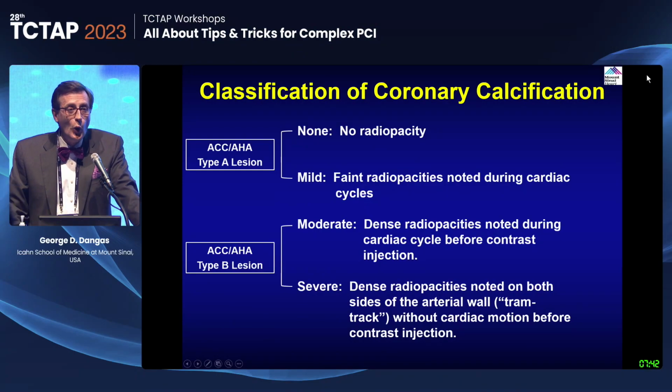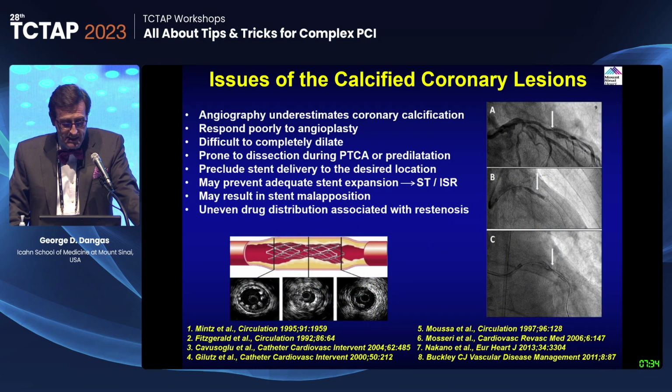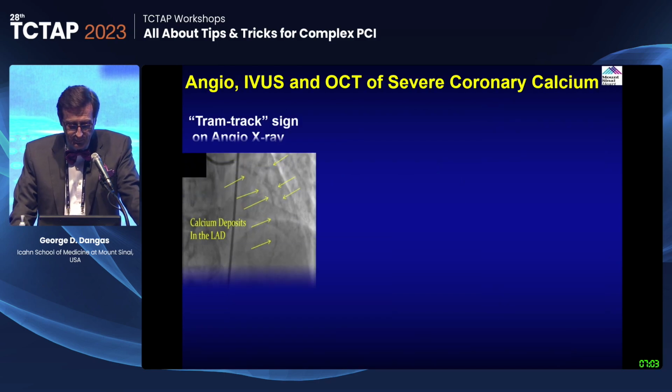And indeed, there are very old classifications of the calcifications of the vessels. You can see the original classification, as well as why we're dealing with calcium. That's the most staggering example, because we may end up left to deal with a stent that is terribly underexpanded because, in retrospect, we regret we underestimated the calcium and did not treat the calcium in time, because we underestimated the severity of calcium in that specific vessel, in that specific lesion. That's exactly what Dr. Mintz showed us about the individual patient assessment.